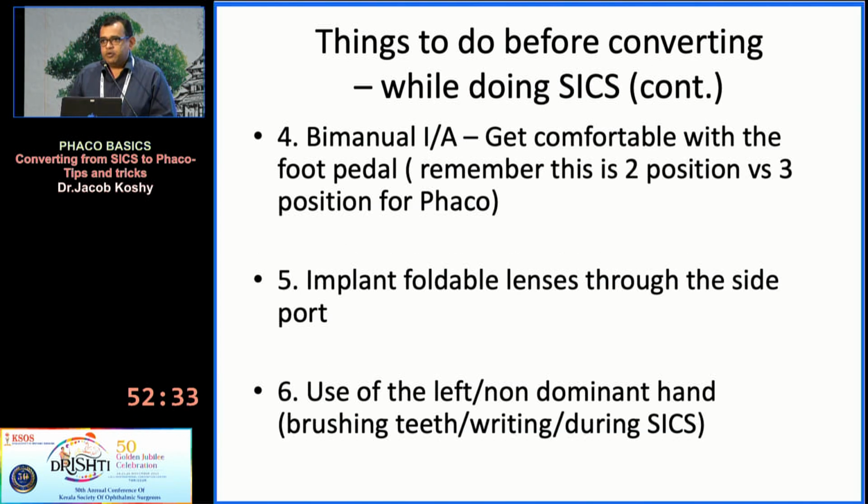Now, this is a very important step that I suggest to all my juniors, and that is to get comfortable with the Phaco foot pedal. Try and do bimanual IA. You can make 2 small side ports on either side and do the IA through that. That is just to get used to the Phaco foot pedal. Remember, there's a difference here. You have only 2 positions, irrigation and irrigation aspiration. You don't have 3 positions like you have when you're doing Phaco proper.